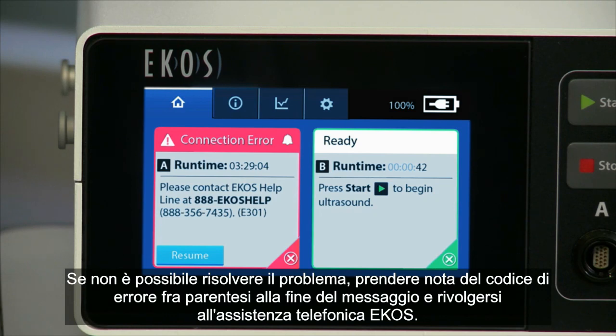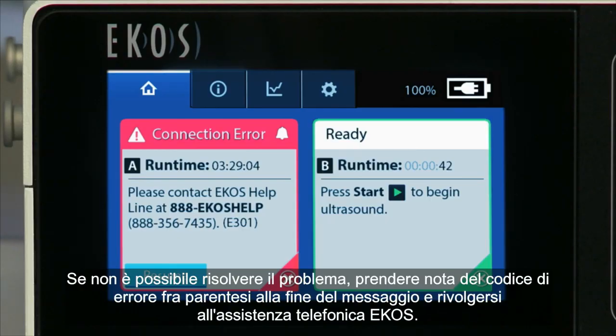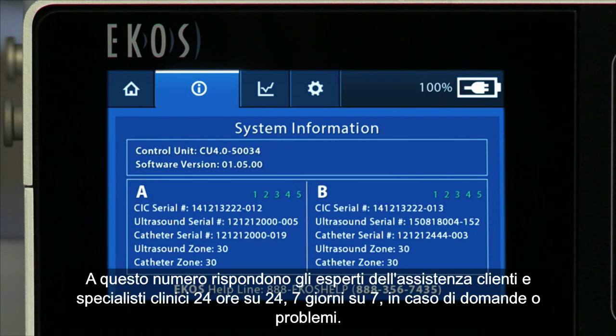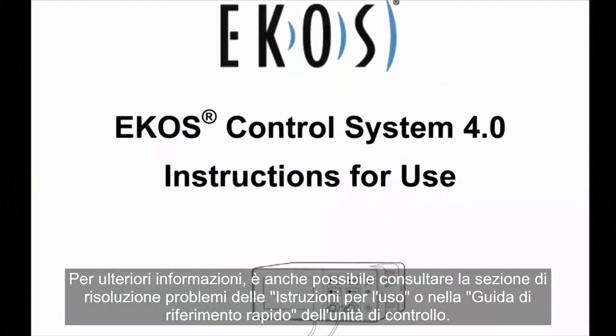If the issue cannot be resolved, note the error code in parentheses at the end of the message and contact EKOS helpline. The U.S. helpline number can be found under the Systems Information tab. The number is staffed by customer service experts and clinical specialists 24/7 should you have any questions or concerns. Customers outside the U.S. can contact their local EKOS representative or call the number on the screen.